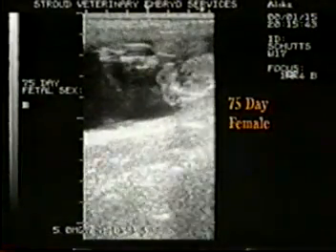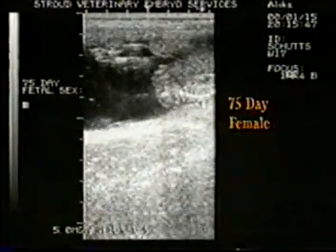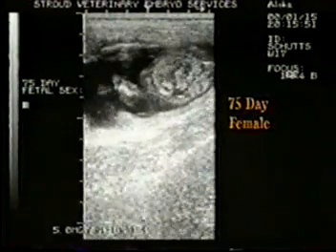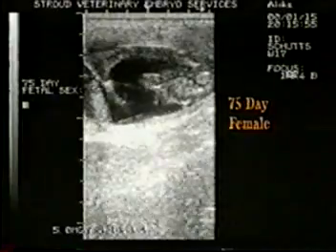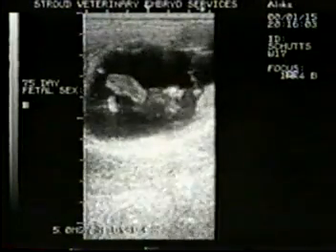Moving caudally to the thorax, the beating heart is another important reference point. The fetus is now on its back, giving the viewer a frontal view. The umbilicus is the reference organ and is highlighted blue.